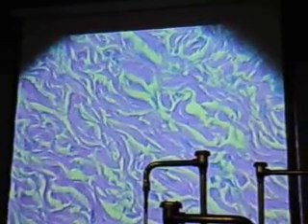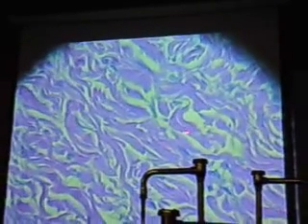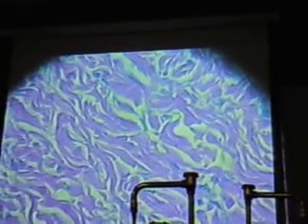What's the cell type that we find there? One there, one there, one there. Fibroblast.